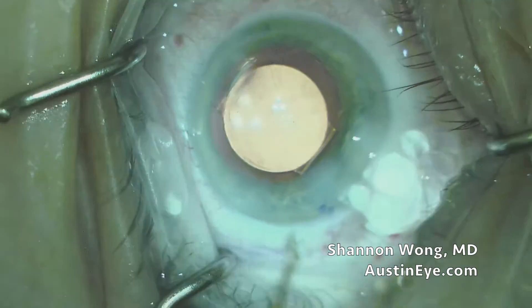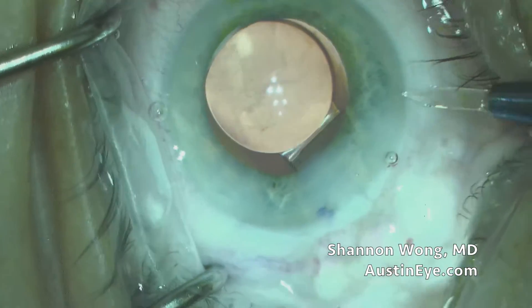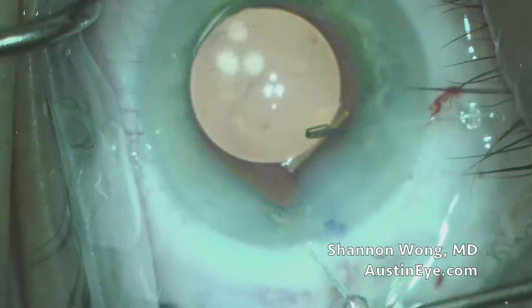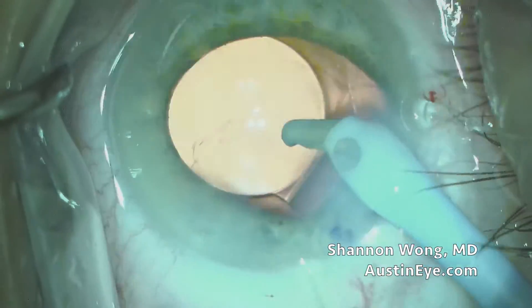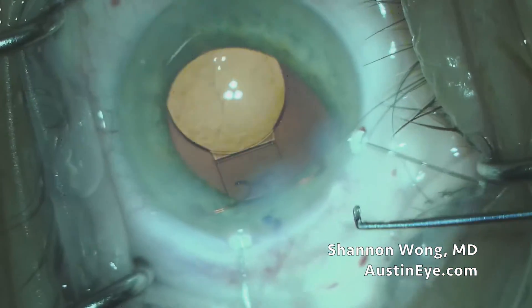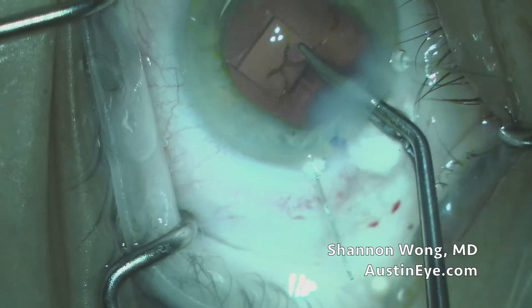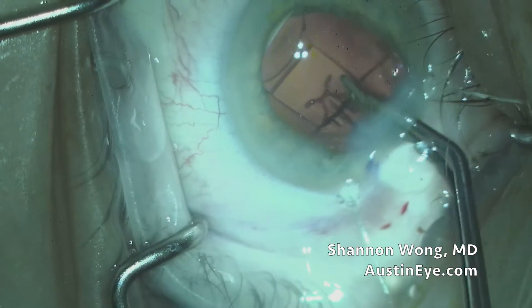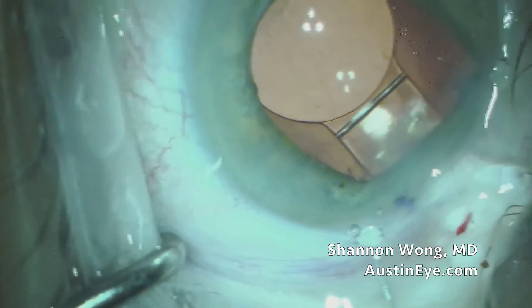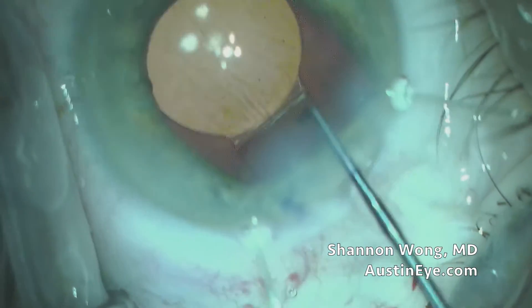The problem here is this patient's pupil is relatively small. We use viscoelastic to try to viscodilate the pupil and expose the area of the lens and the capsule below the incision. Ultimately, we have to resort to using iris retractors to visualize the anatomy. We find that the trailing haptic was trapped in the ciliary sulcus, and we had to free up the lens and gently place it back into the capsular bag. We could never see and confirm placement of the trailing haptic into the capsular bag unless we had placed these iris retractors — no viscoelastic, no instrument was able to show us that conformation.